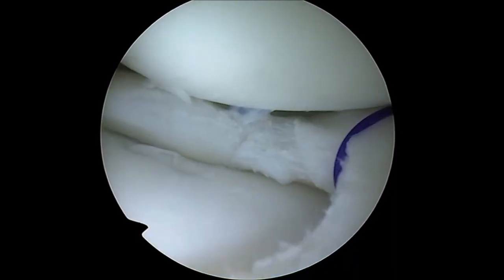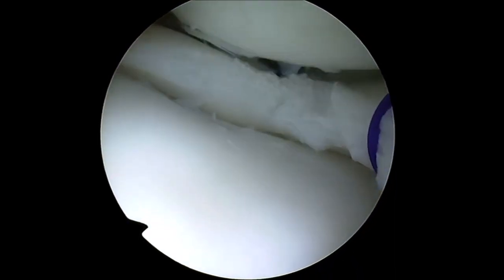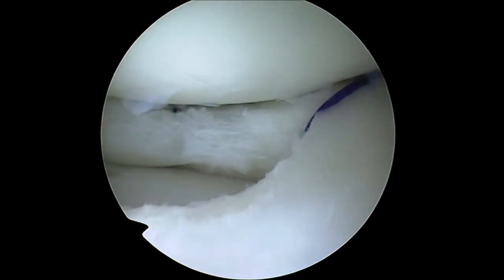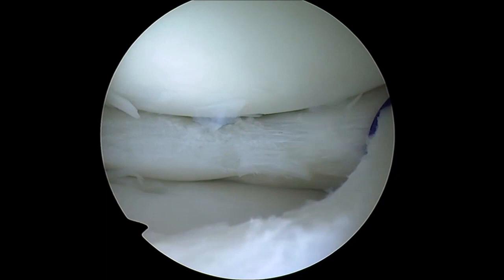After the repair, stability is tested with a probe, and if needed, complementary repairs should be performed. Finally, this is the final aspect of the repaired meniscus.